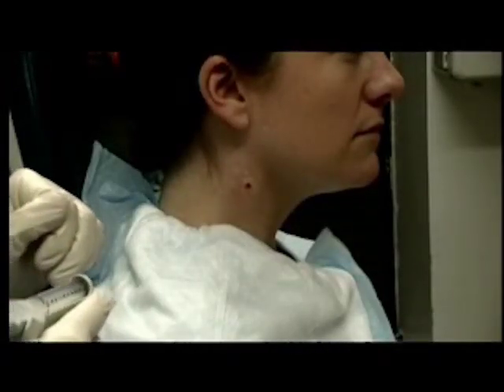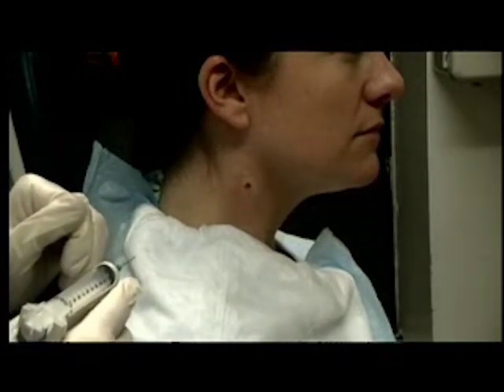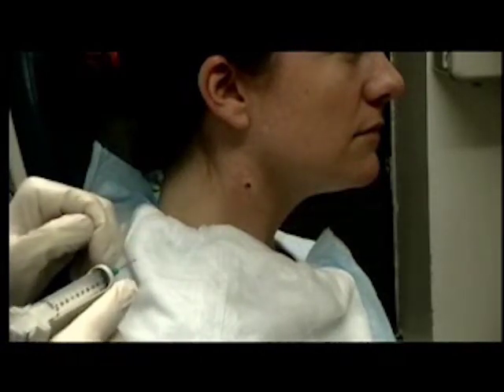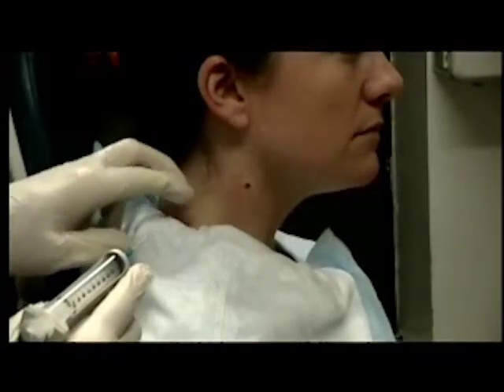This is a demonstration of the aspiration technique. As you can see, we have an anterior cervical node, which we're going to do a fine needle aspiration on. It's been localized and marked, and local anesthesia has been applied to the skin.